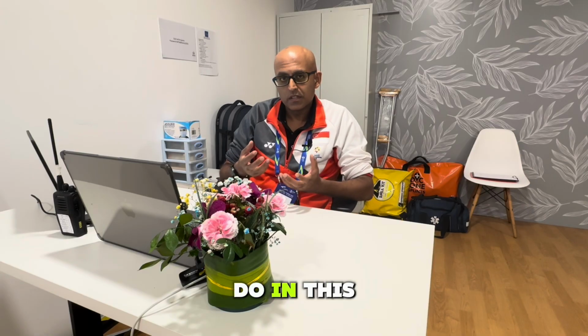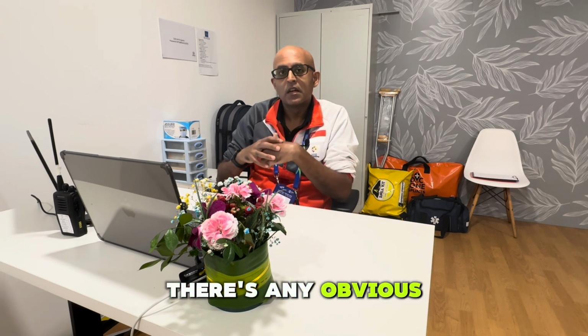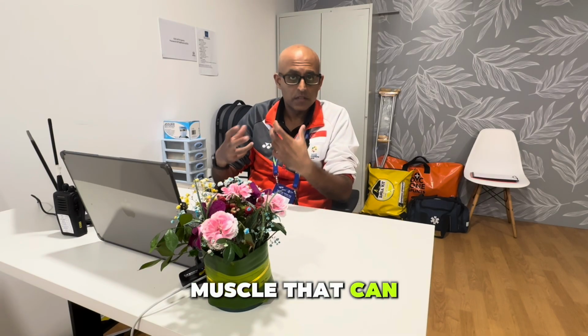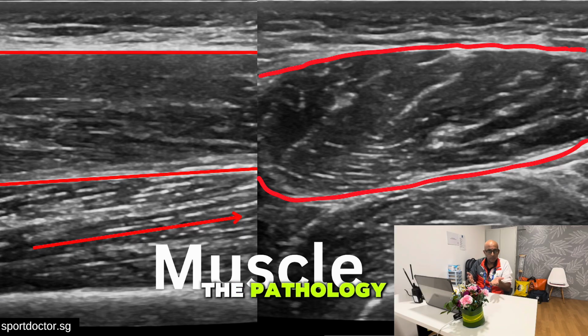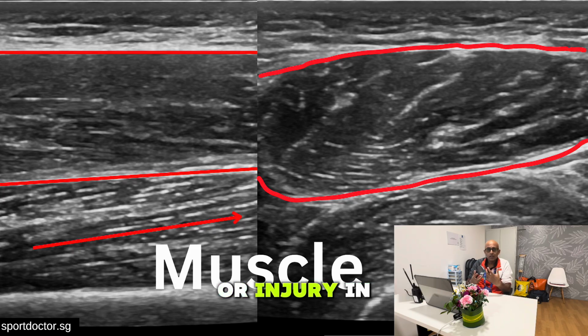What I normally do in this situation is place the transducer in a short axis orientation and run the transducer up and down the muscle to see if there's any obvious glaring tears or disruptions of the muscle that can be seen. Once you've identified a pathology, you can change the transducer into a long axis orientation and then have a look at it in more detail. When evaluating it, it's important to measure the disruption or injury in both the long and short axis.